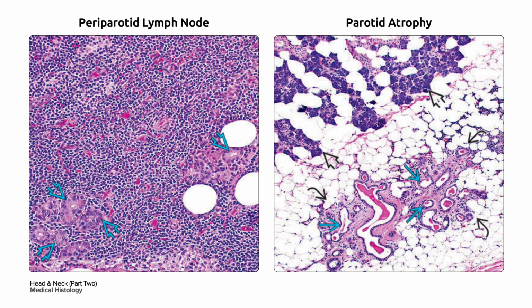On your right, focal areas of atrophy in the curved black arrow are common in excised parotid glands, in the bold black arrow. These result from excretory duct obstruction and may mimic neoplasms. Acini are lost and only ducts with periductal fibrosis in the single blue arrow persist.